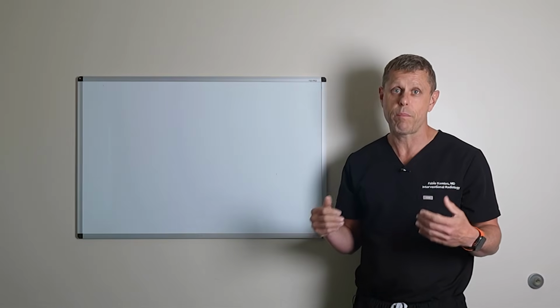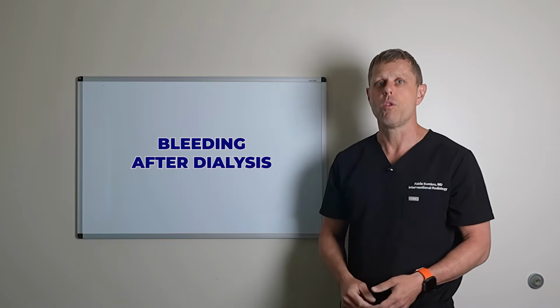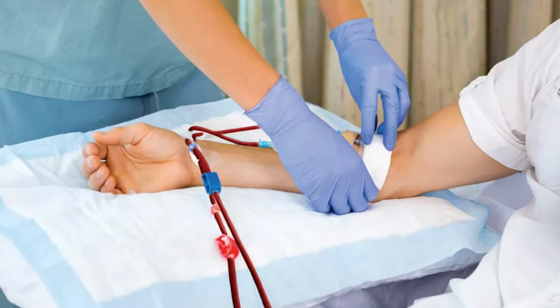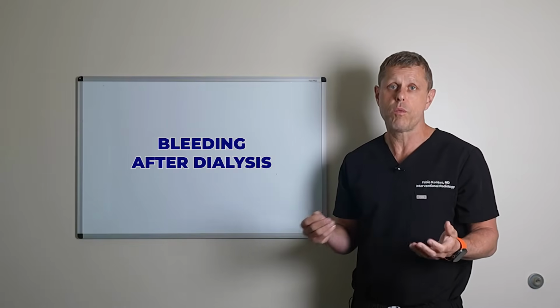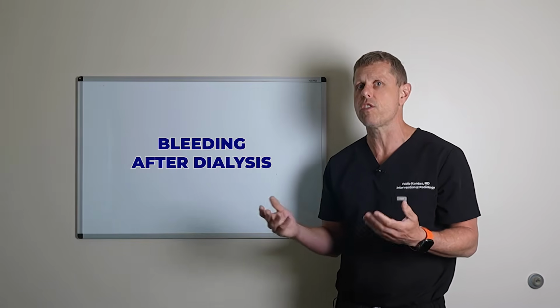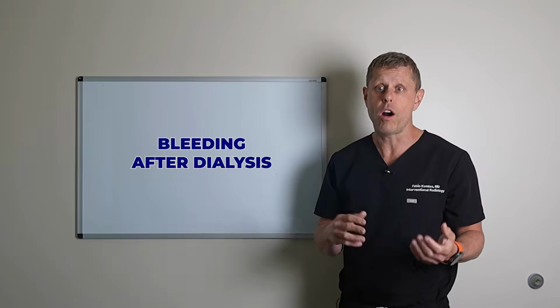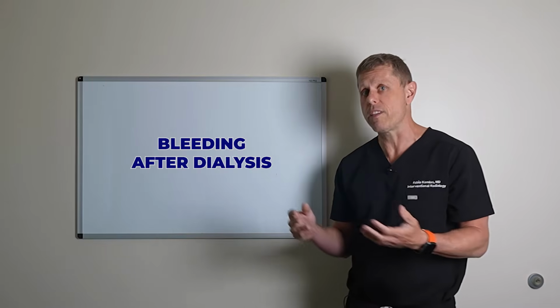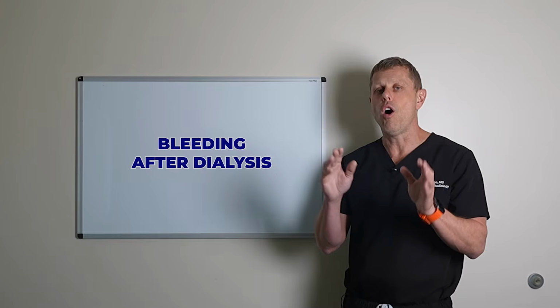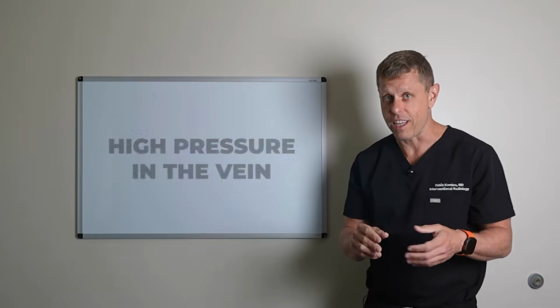Another common problem that patients experience is bleeding after dialysis. As you know, the way you do dialysis, you put 2 needles into the dialysis access. And once you remove the needles, it can bleed for a couple of minutes and they hold pressure for a little bit, but it usually stops and it's not a problem. But what if it takes a long time to stop, like nurses are holding pressure for more than 10, 15, 20 minutes, even half an hour, or they were able to stop it, but when you go home, it starts bleeding again.